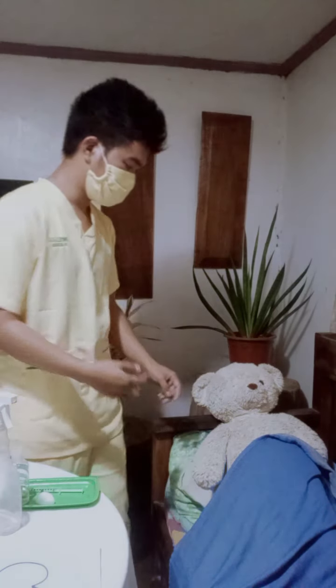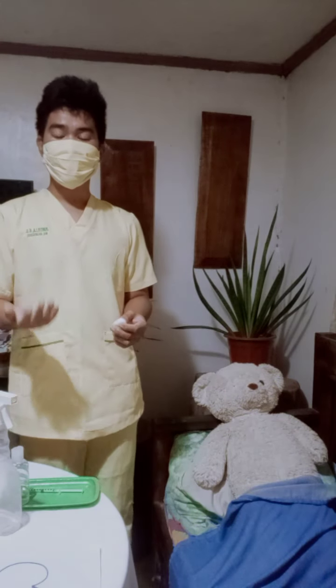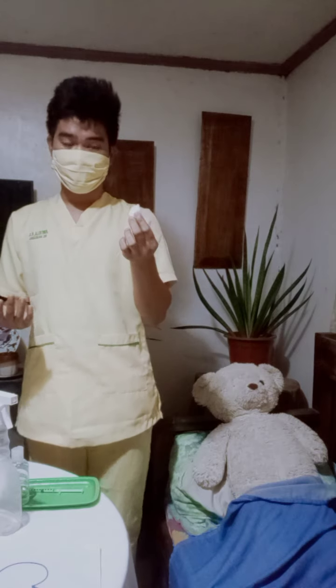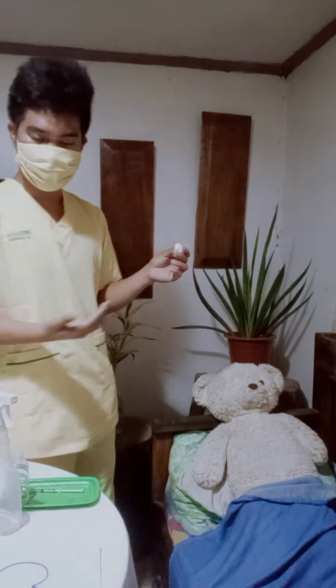So next, we're going to administer the injection. First, we're going to clean the injection site with alcohol. So I have here my cotton ball soaked with alcohol. We're going to clean the abdomen in a circular motion.